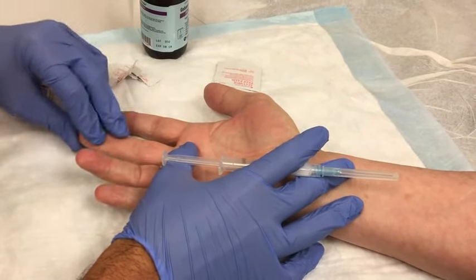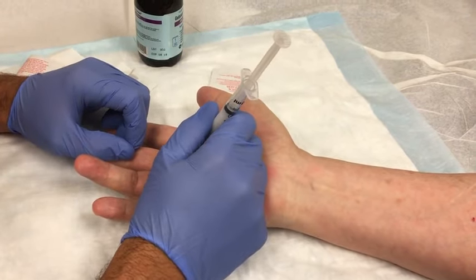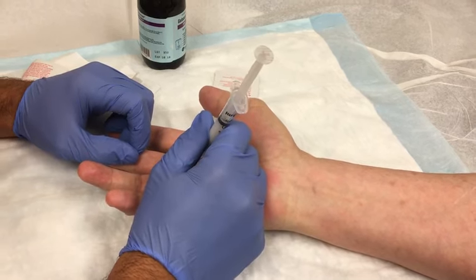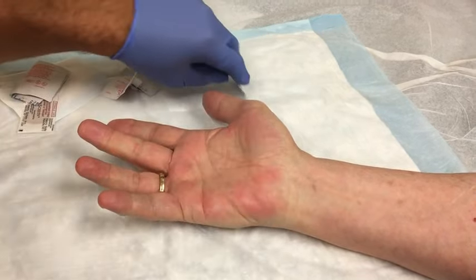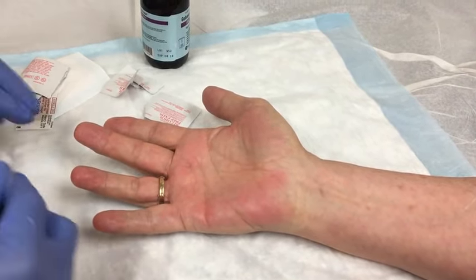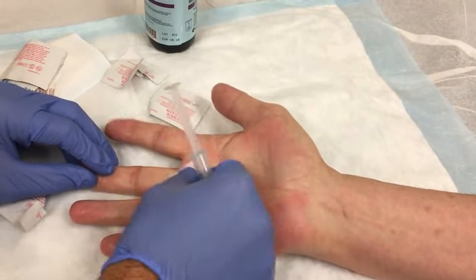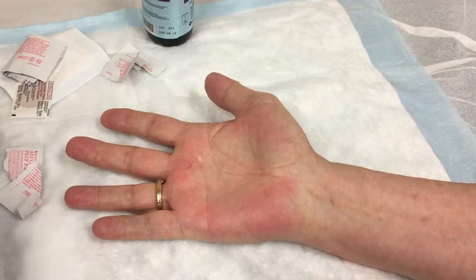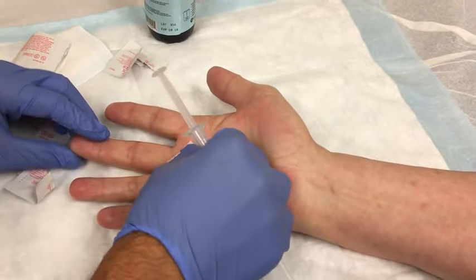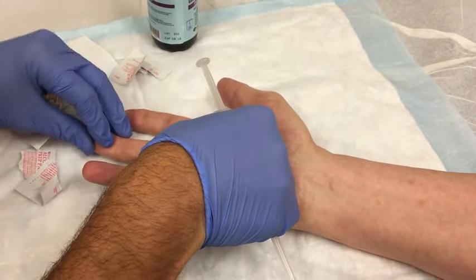I can feel that snapping over the A1 pulley. So I'm going to go ahead and mark the skin with the needle cap, and I know where my injection site entry is. Then I'll wash the hand off with some alcohol. And again, feeling my A1 pulley snapping over.